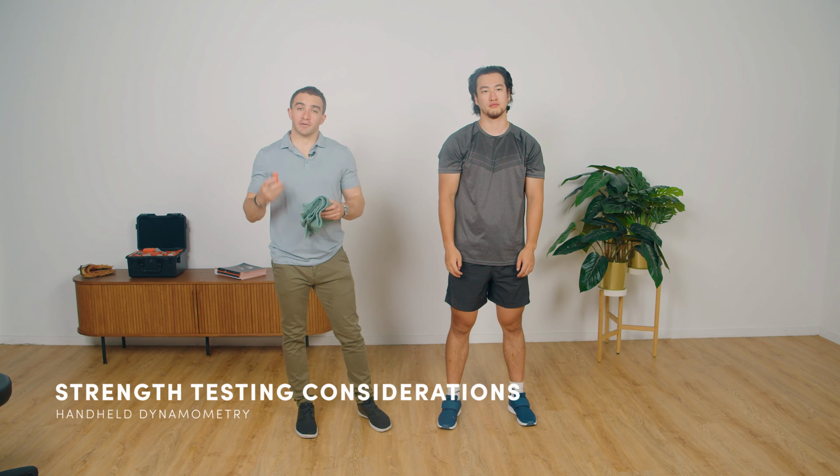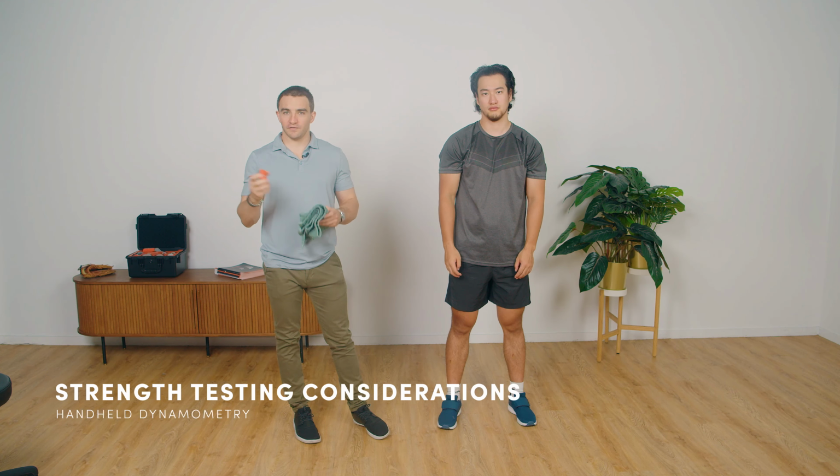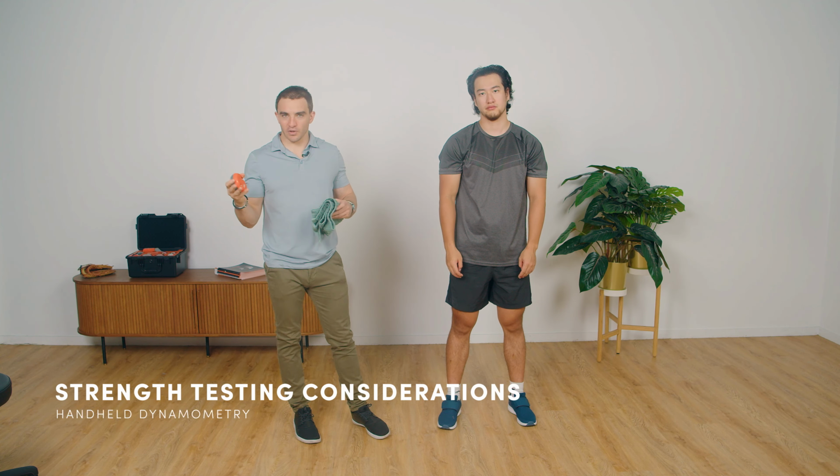So we just spoke about how we can strap the dynamometer onto the patient's hand to give them early feedback of how much force they're applying after injury, after surgery, when we're in the early stages of rehab. But we want to consider a few things as we start to progress our strength testing. So we're going to discuss a few different ways to do handheld dynamometry as well as fixed frame dynamometry when our patient's starting to get stronger.